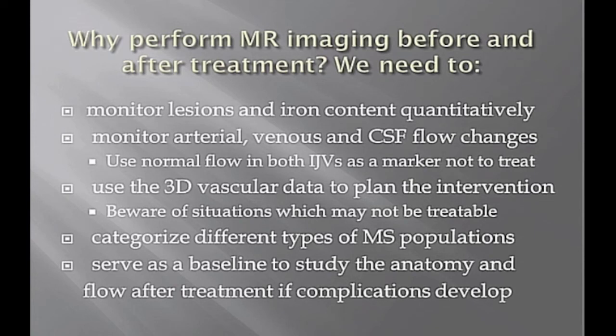So again, I want to point out here why it's important that patients have MR scans. If I were a neurologist, I would say, I want this to monitor the lesions and other physical or anatomical abnormalities. I'm interested also in the iron content. I want to monitor the arterial, venous, and CSF flow changes, actually the flow itself before and after. Why? Because if there's normal flow in the IJVs, maybe you don't want to treat these people. You want to use the 3D vascular data to plan your intervention.